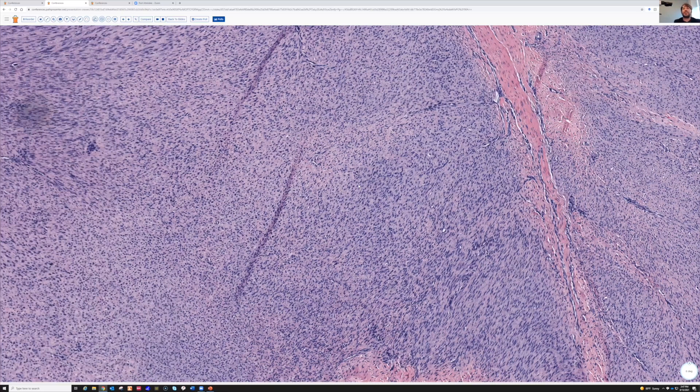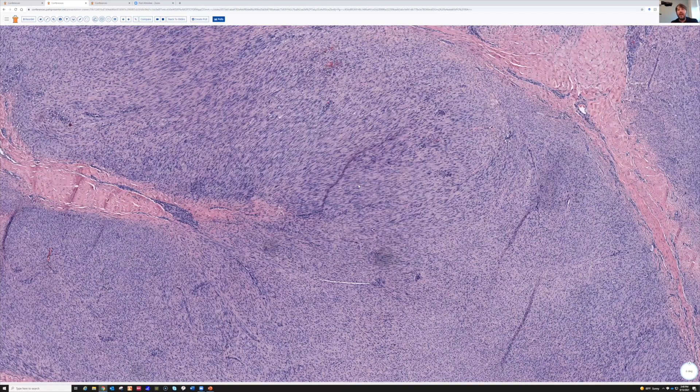Fibromatosis in the palm, also known as Dupuytren's contracture, has the same features as this, but it's usually very small, very subtle, and low on cellularity. Sometimes I get a removal for Dupuytren's contracture and I don't find any fibromatosis at all — it's just fibrotic tendon with no parallel fascicles of spindle cells. On the foot, the opposite is true. The foot fibromatoses are usually big, usually more cellular, more hyperchromatic, and more mitotically active.